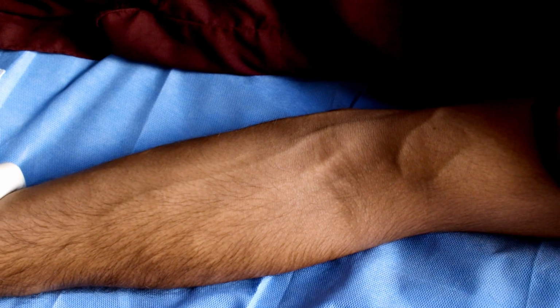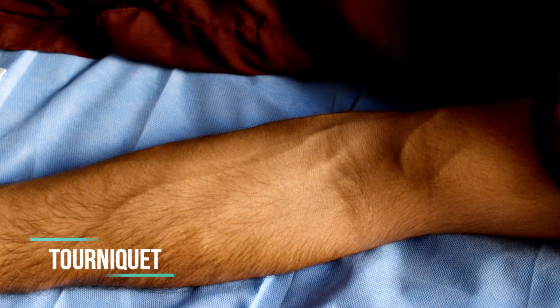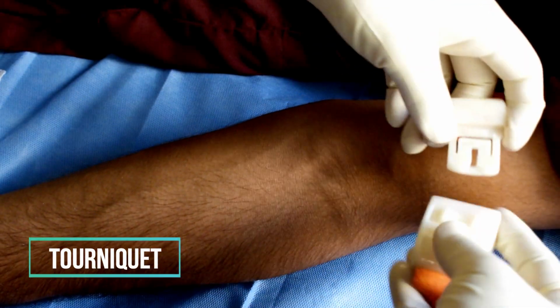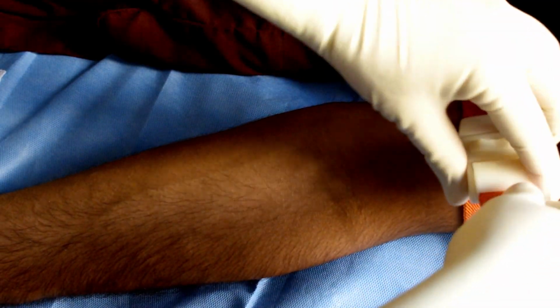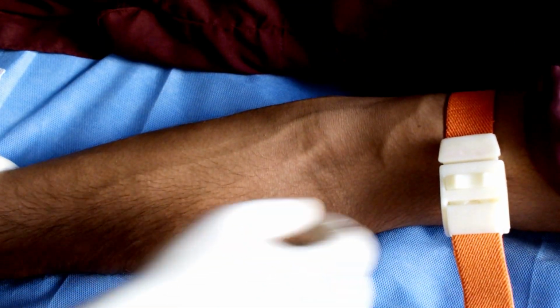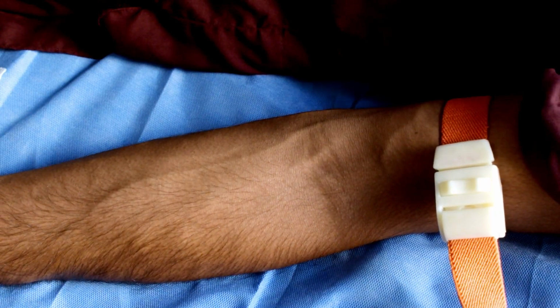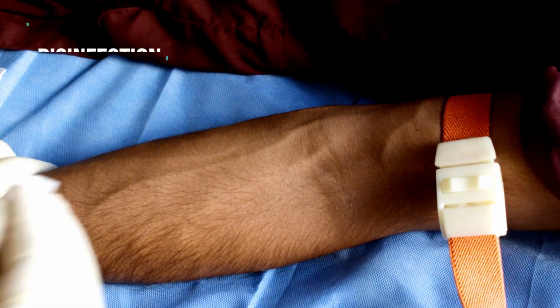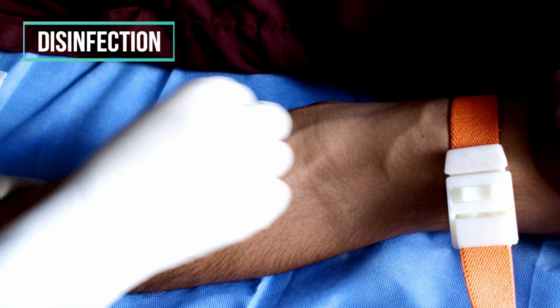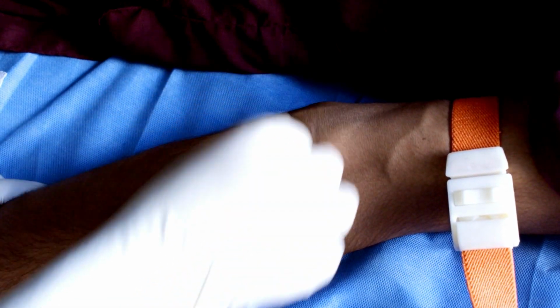This patient has vessels that are very prominent and very easy to visualize. A tourniquet is applied, limiting the flow of blood. The tourniquet helps in the visualization of the vessel. The skin at the site of the cannulation is disinfected using an alcohol swab in a circular motion, and then the area is allowed to dry for some time.